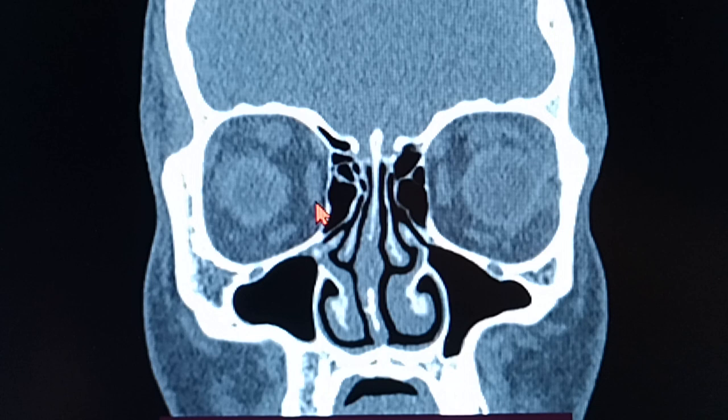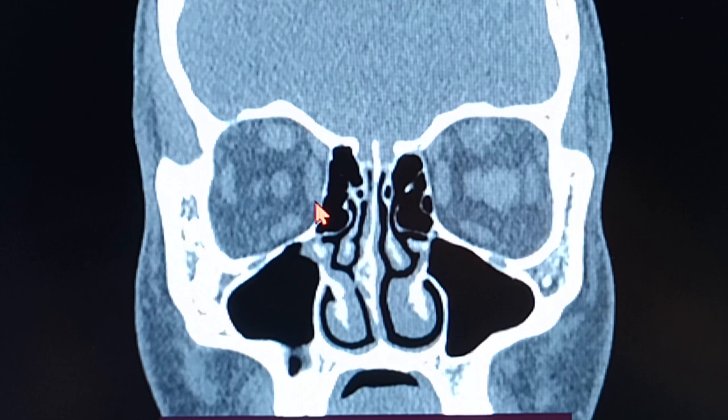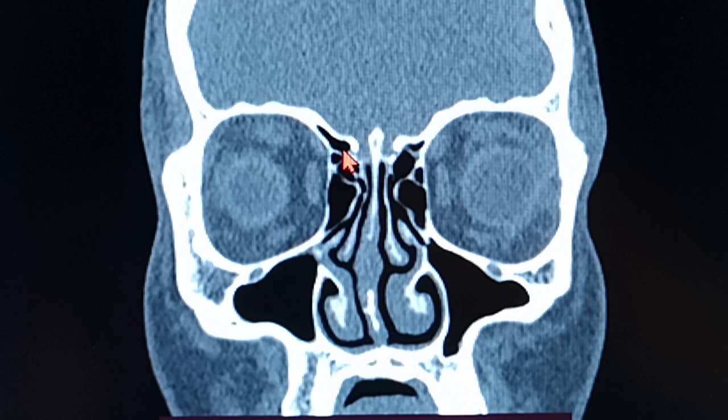Because if you go inside and open up the patient endonasally, you should not have any surprises regarding the skull-base anatomy, a CSF leak, or any aberrant internal carotid artery, or the presence of an Onodi cell, which you're not aware of. If you're opening the sphenoid sinus, you can damage the patient's optic nerve. If you're operating for a case of ethmoidal polyposis and you open the sphenoid and damage the patient's optic nerve, that's a disaster, right?